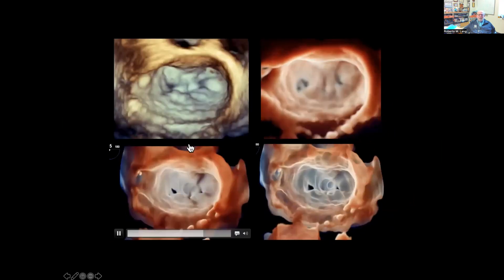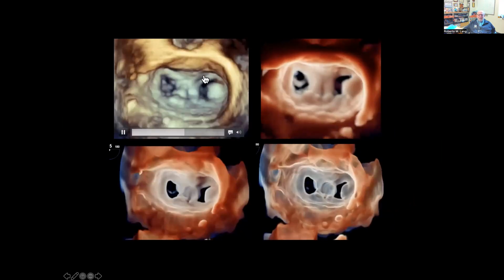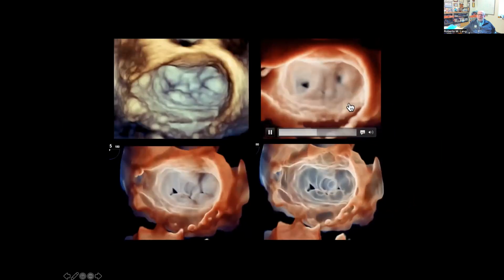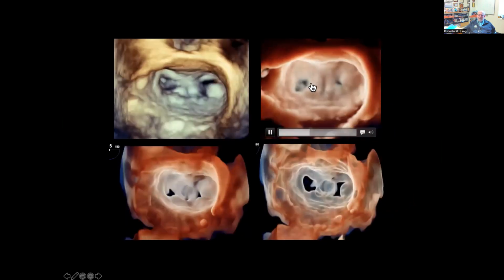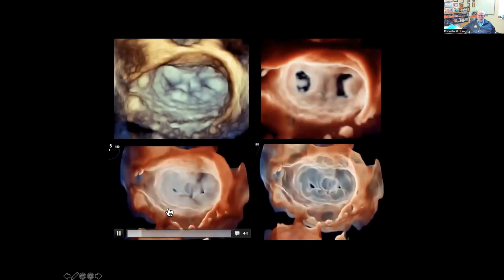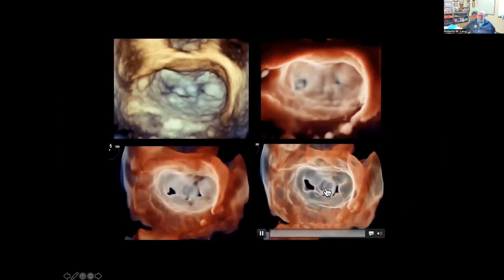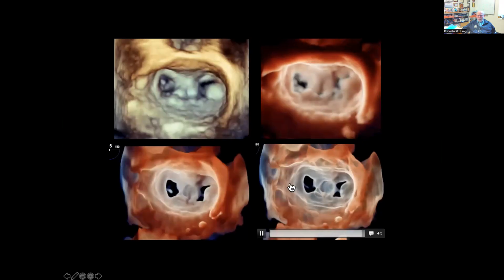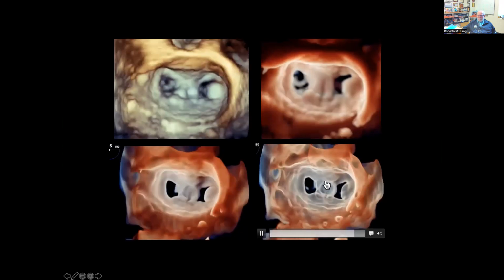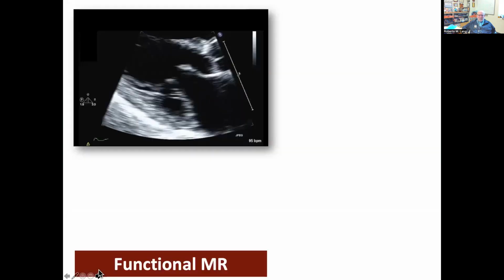This is a patient with an Alfieri done by a mitral clip. This is the 3D that we used to get. This is the 3D in which we insert a source of light in order to create shadows. And here you can see how nicely we can see the openings and these borders, how clearly these borders are seen. And we actually make the adjacent tissue more transparent. We can start seeing very nicely the clip that we had not seen before.